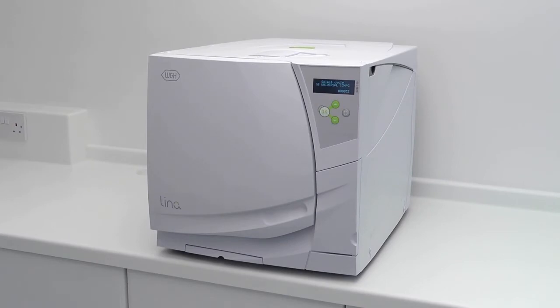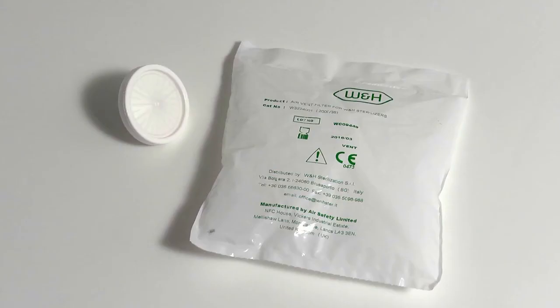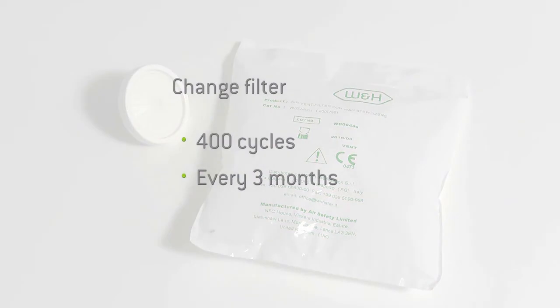Before proceeding to replace the filter, you must ensure your steriliser is not running a cycle. The bacteriological filter should be replaced at regular intervals of 400 cycles or every 3 months, whichever is sooner.